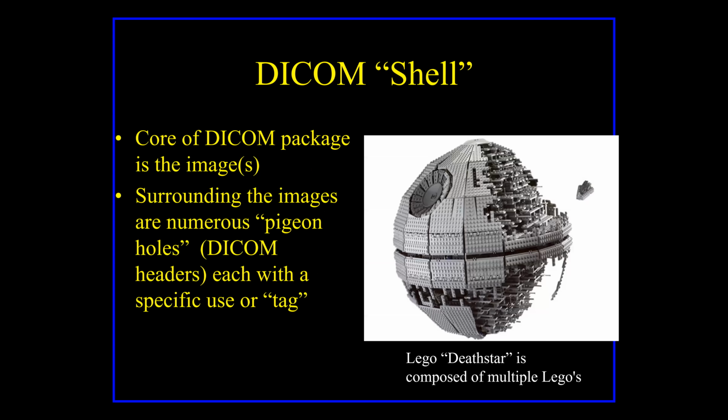And the cool thing about DICOM is if you think about the images, if I was going to email you an image of my dog, what are you going to get? I'm going to attach it to the email and you're going to get a JPEG image of my dog. Does that image tell you my dog's name? Does it tell you the dog's sex, how old the dog is, if there's anything wrong with it? No. But the thing about DICOM is so much more goes with it than just the images.